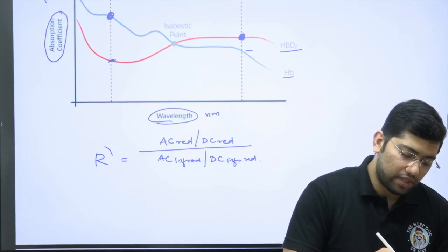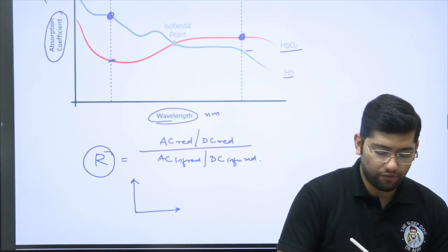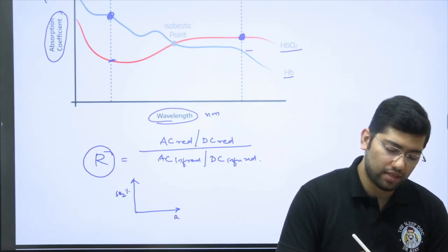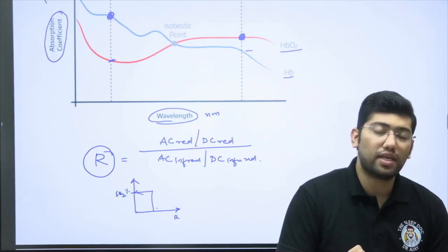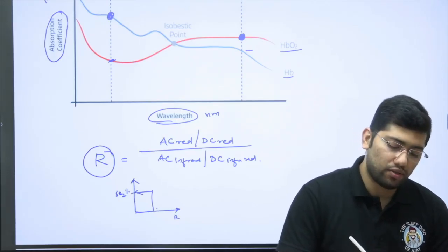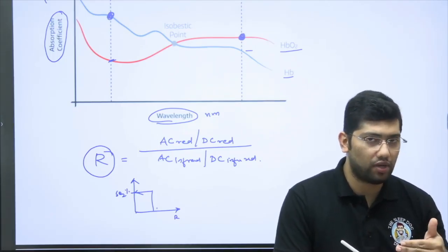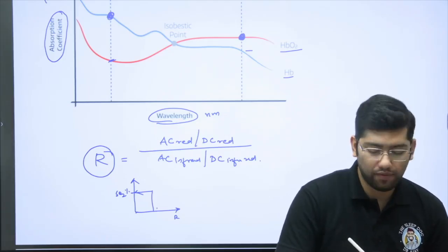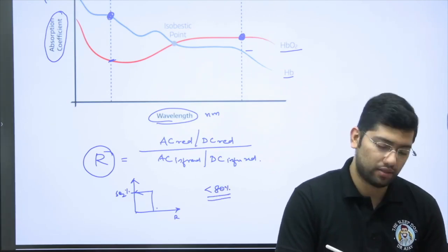Now, after this R value is determined, it is plotted against a graph where R values are mentioned on the x-axis and corresponding saturation in percentages are mentioned on the y-axis. Each R value would correspond to a saturation level. Now, this is done through healthy subjects, who were subjected to hypoxia with various levels of saturation, and the values were tabulated and then extrapolated. That's why we say the pulse oximeter is not accurate below 80%.